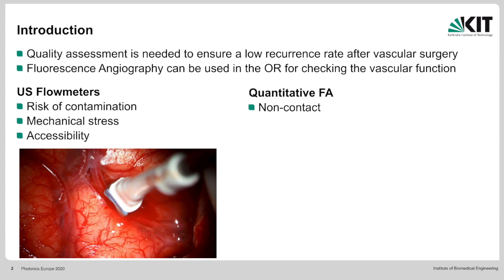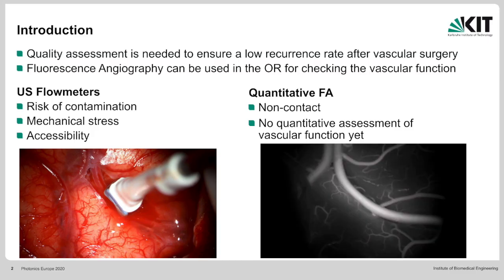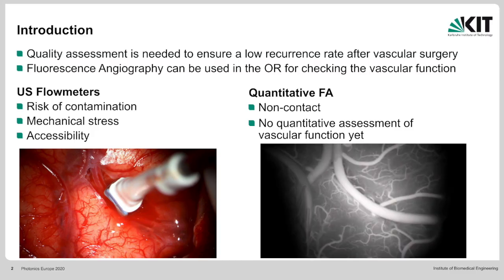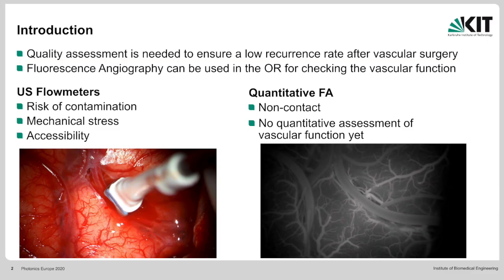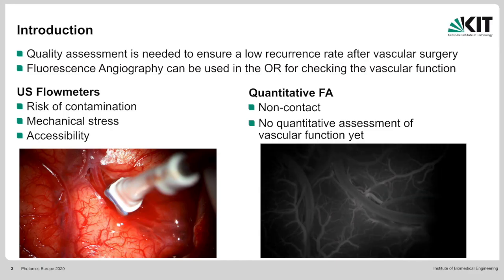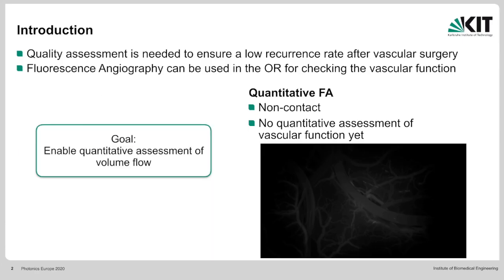So what about fluorescence angiography? It's a non-contact method, and unfortunately until now no quantitative assessment of the vascular function is possible. You can see on the right-hand side the current state. This is what the surgeon gets from the system: he sees the blood flow dynamics. So our goal is to enable a quantitative assessment of the volume flow.